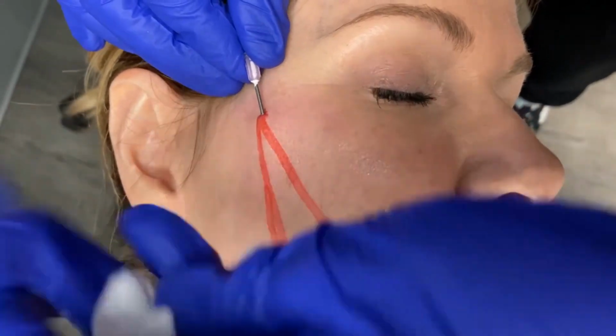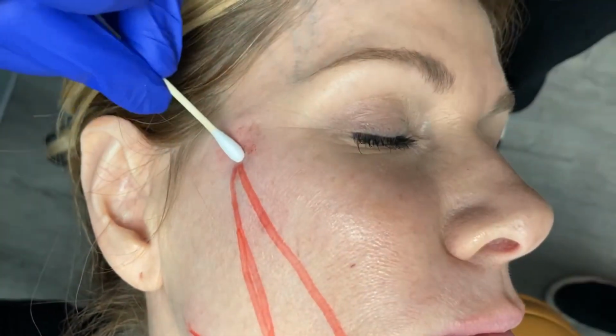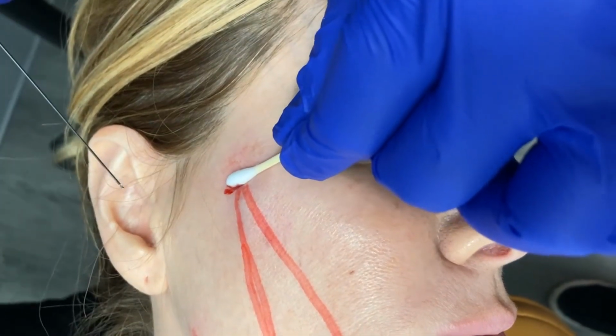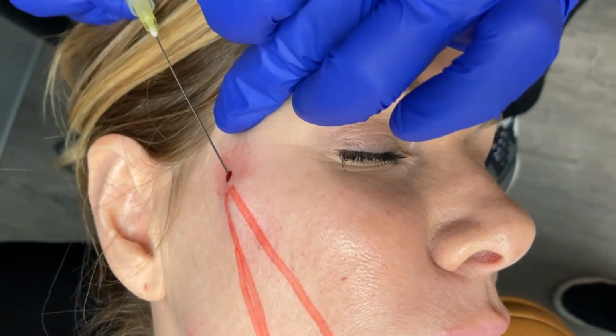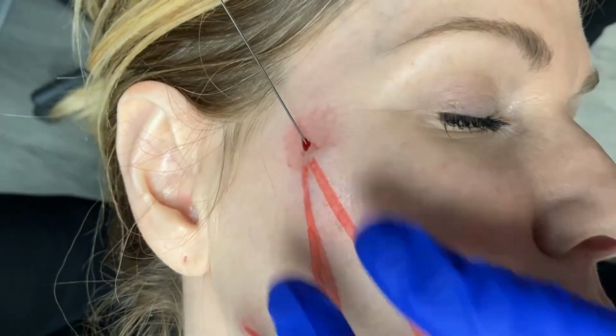This is why you need some live patient lifting PDO thread certification training with the AAFE, because this is the beginning of the entire procedure there, and you'll get a little bit of bleeding many times, and that will help you determine where that entry hole is, so you can easily go ahead and find it, because sometimes it can get a little tricky until you've had some experience with this. So now let's get in here.